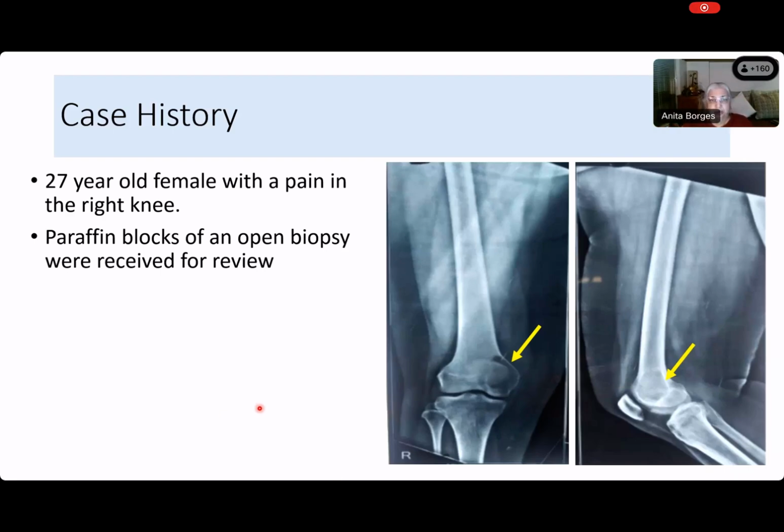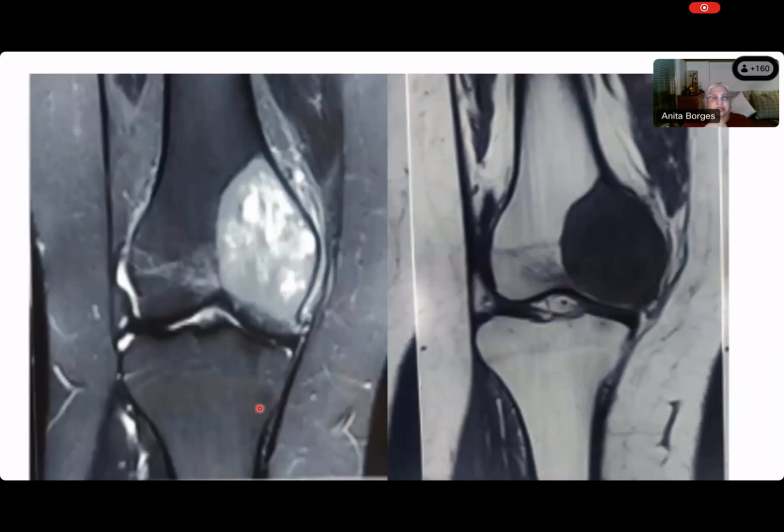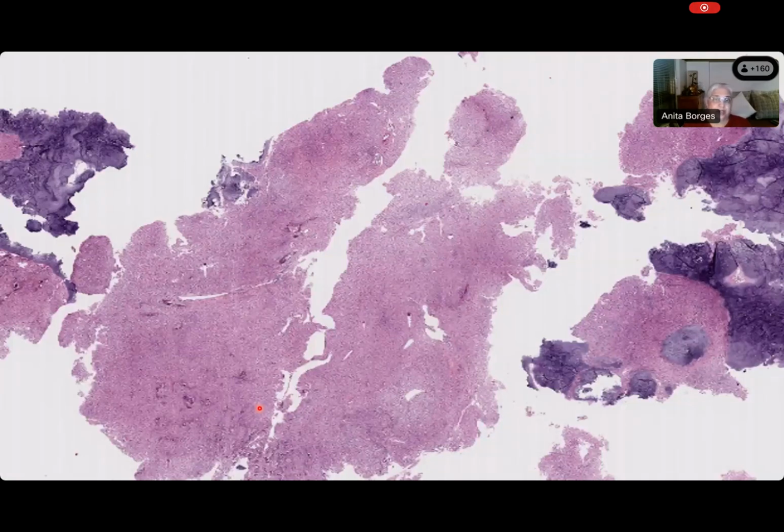All right, now. And that's the same thing. Here you have got MR, and you can see it black, you can see it white, whatever. And that's the MR, and it shows you that beautiful circumscription. All right. Now, come on, Prayas. You think it was cystic? This is what you're seeing here is cystic?